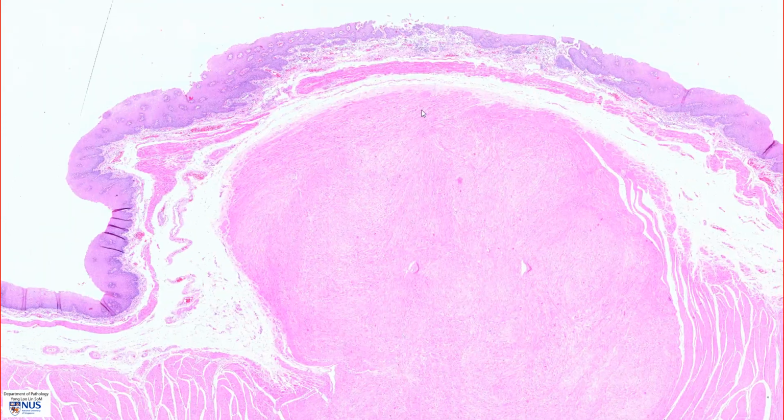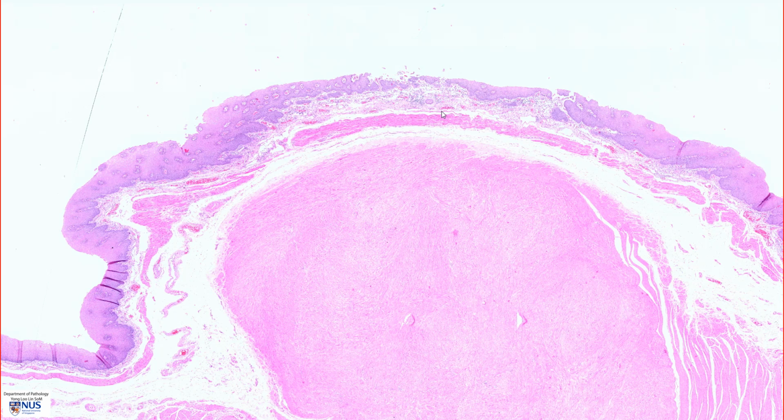This is a very well circumscribed, rounded nodule. There is no capsule, but you can see that it is very well demarcated. There is no evidence of any invasive growth into the wall of the esophagus or into the overlying mucosa. In this instance, this tumor compresses the overlying mucosa, but in some cases, it can actually cause ulceration into the overlying mucosa and then potentially GI bleeding.